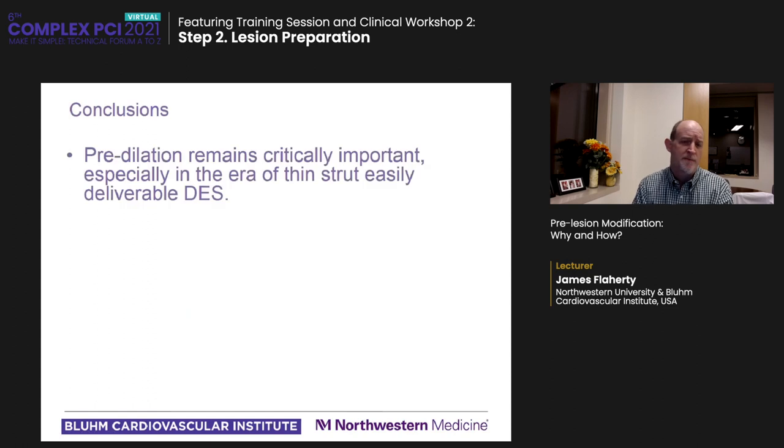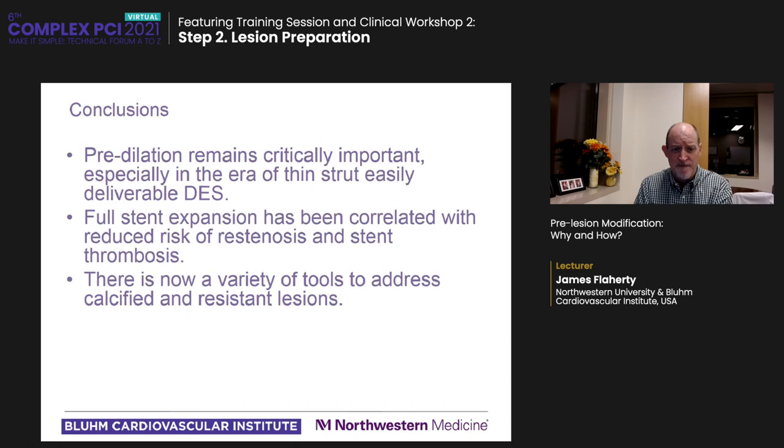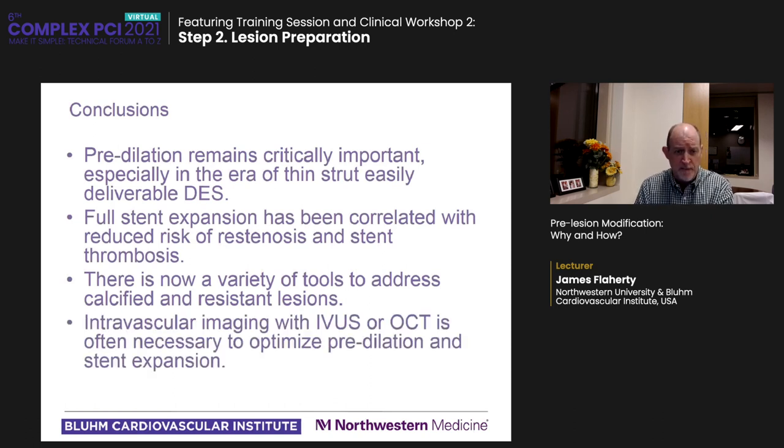So in conclusion, predilation remains critically important, especially in the era of thin strut, easily deliverable DES. Full stent expansion has been correlated with reduced risk of restenosis and stent thrombosis. There's now a variety of tools to address calcified and resistant lesions. Dr. Kirtane will go into this in more detail in the next lecture. And intravascular imaging with either IVUS or OCT is really essential to optimize predilation and stent expansion.